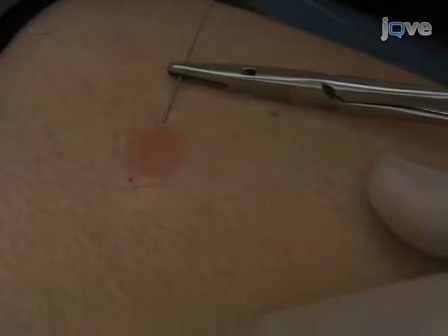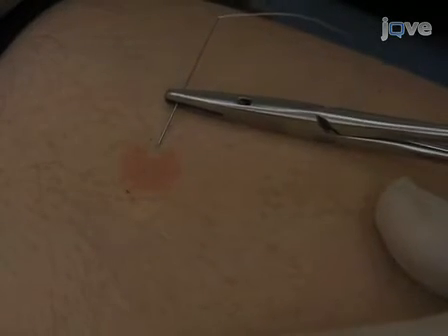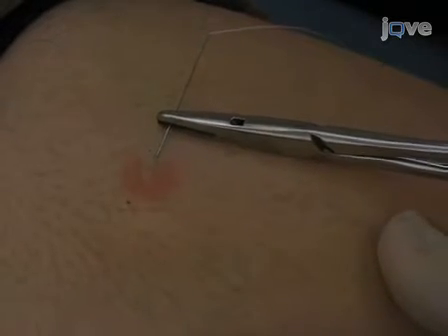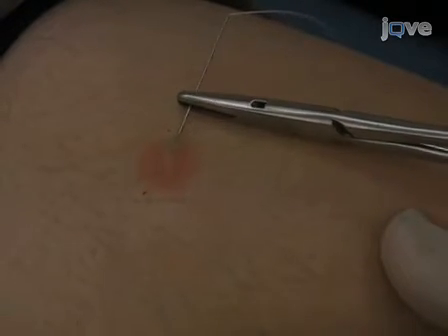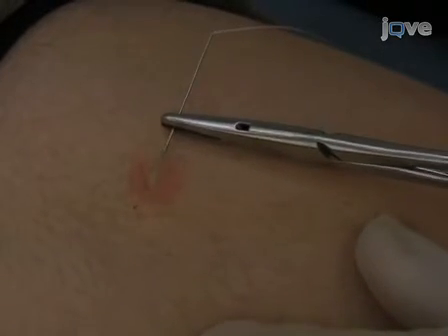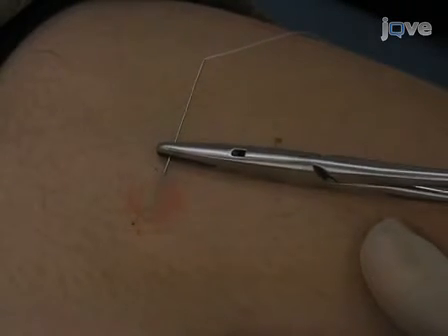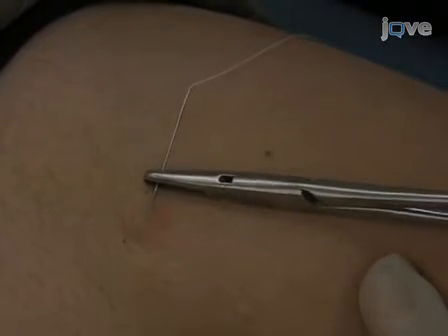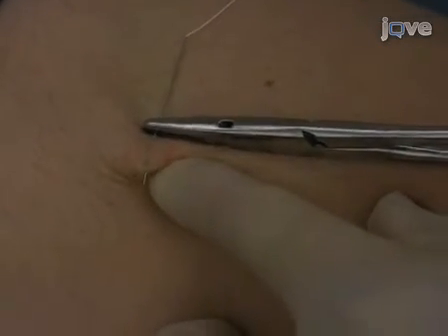Using aseptic techniques, insert the microdialysis catheters with the aid of the attached 23 gauge needle over the length of the explored skin area. The depth of insertion is at the interface between the cutis and subcutis. Adequate penetration can be verified visually. As the needle and the attached catheter are moved forward, the needle should cause a little upfolding of the skin, as well as some blanching of the skin. No bleeding should occur. If bleeding occurs, the needle is located deeper than intended, and the depth of insertion has to be adjusted.